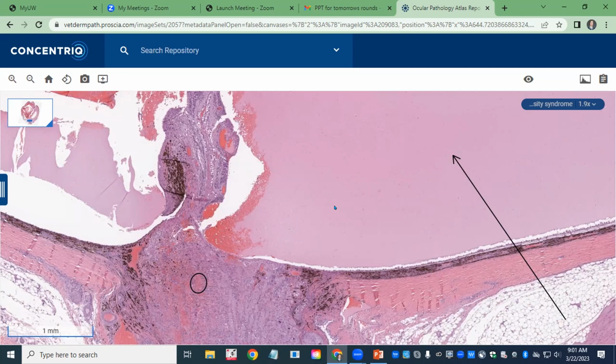Ryan, do you have anything else? No, that's everything. Just to mention, I did put a fibrinoproliferative lesion in this case of hyperviscosity. So one of the annotations is what I believe to be a fibrinoproliferative lesion that Gillian mentioned. And then also, if you refresh it, I just added an annotation for retinal necrosis. Okay. So it should be an area now when you refresh the screen. Do you want me to do that? No, you don't have to. I was just letting everyone know. Live, real-time updates.